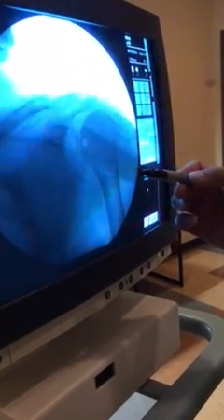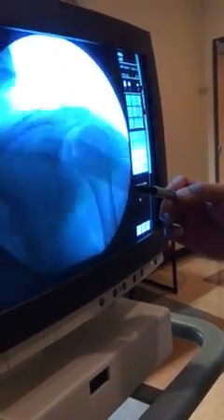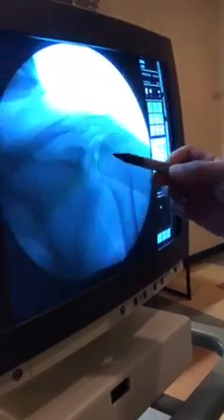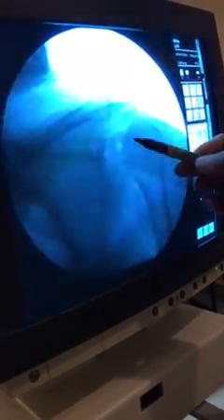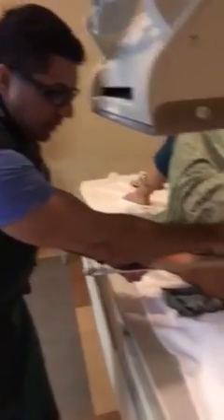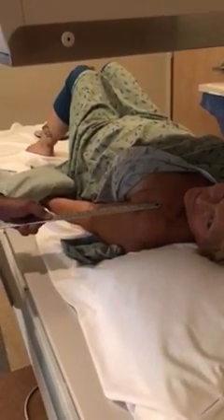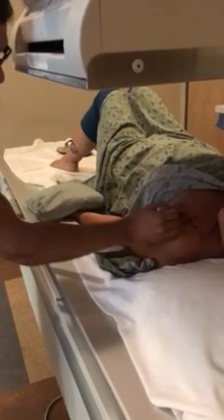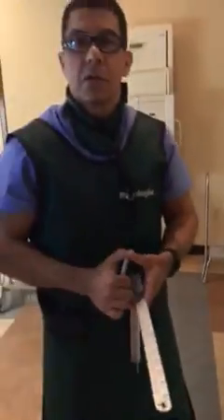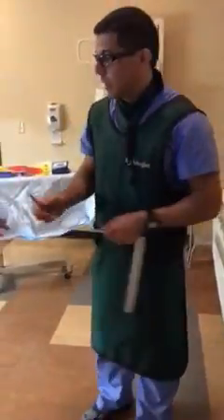I'm using this little metal tool to help me find where I want to go. You can see this is the ideal place — right near the top of the glenohumeral joint, just maybe half a centimeter to a centimeter from the top of the glenoid is where you want to go. So I'm going to mark that spot here on the skin, and then we'll get her cleaned off and numbed up, and I'll show you where to put that needle.